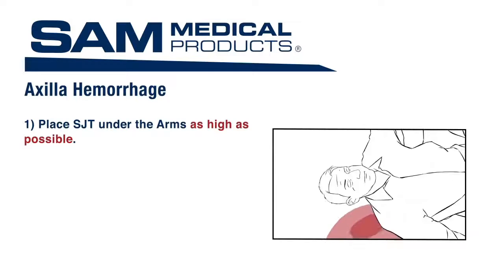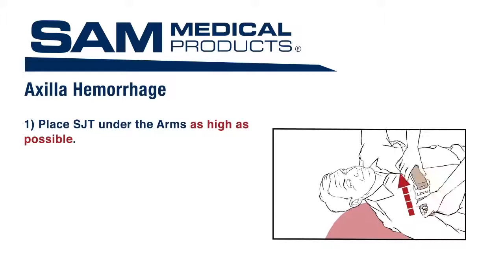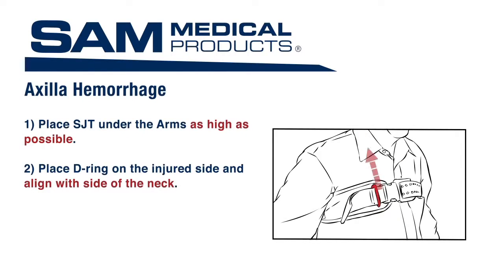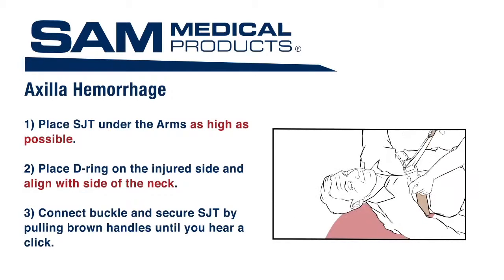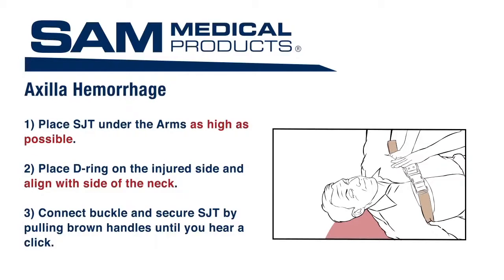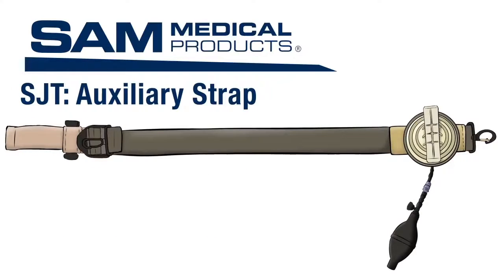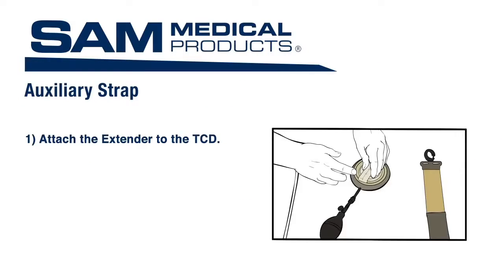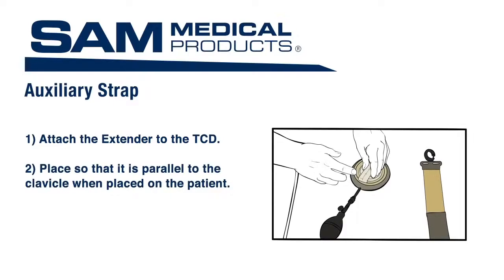To control axilla hemorrhage, apply the SJT to the patient under the arms as high as possible. Place the D-ring on the injured side, aligning it with the side of the neck. Connect the buckle and secure the SJT by pulling the brown handles apart until you hear a click. Maintain tension and fasten the strap in place by pressing it down on the Velcro. Next, locate the auxiliary strap and the TCD with the extender. Attach the extender to the TCD prior to application.